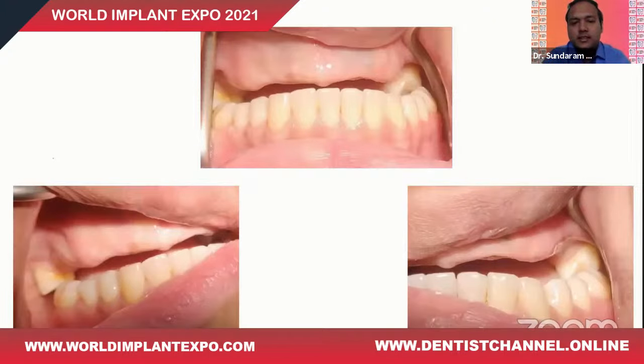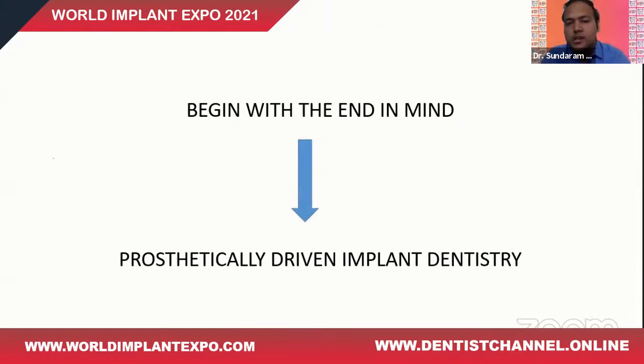Now this slide represents the clinical pictures of an edentulous patient of the maxilla, class 4, Kennedy's classification. Whenever you plan for an implant in any patient, it is always better to know how the final prosthetic workup would be.